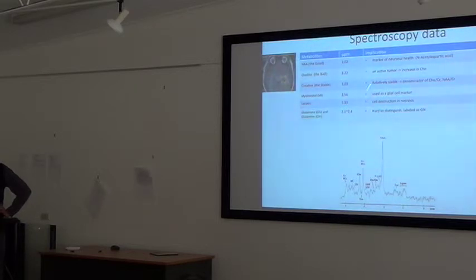This is where I pick seven major ones. There are four big brothers, which are NAA, choline, creatine, and what I call MI. And then some little ones: lactate, and there's a twin brother pair, glutamate and glutamine. So NAA is this resonance at 2.02 ppm, and it's usually the marker of neural health.